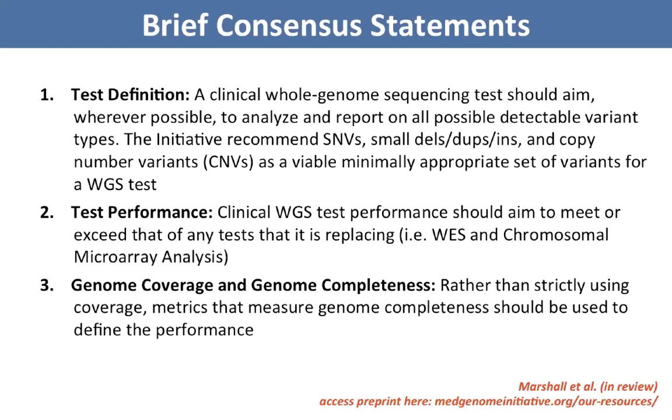Number two was around test performance. The consensus here, related to number one in the test definition, was that you should be able to take that aspect of the genome sequencing, and it should meet or exceed that of any of the tests it's replacing. The obvious tests that clinical genome sequencing would be replacing are whole exome sequencing and chromosomal microarray analysis. So during your test performance, you should be meeting at least those standards.